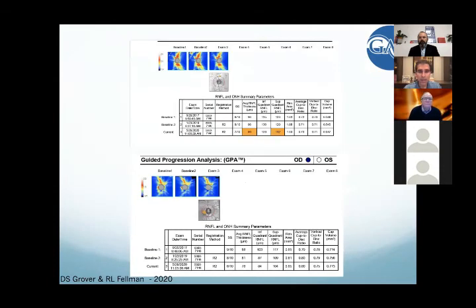And then if you look at her OCT, on the top is the left and the bottom is the right. The third test, number 3, on May 29th, that's obviously the post-pandemic. And we didn't really get the best quality, whether it's the dilation or the masks or whatever. Our signal strength was a little down. But if you look from 2017 to 2019, I would say there may have been a little bit of change in the left eye, but I wouldn't call that a real progression on the left side. And even with the signal strength of 7 out of 10 with the possible thinning, I would want to see something more before I would ever call that progression on OCT on the left eye.